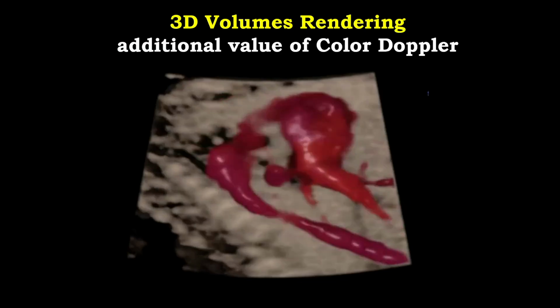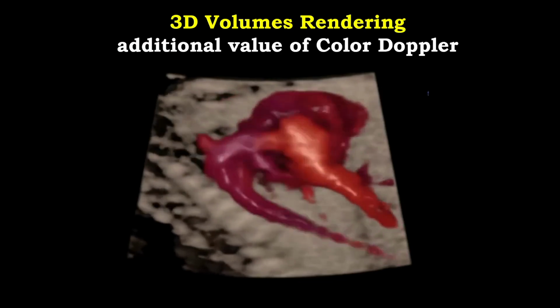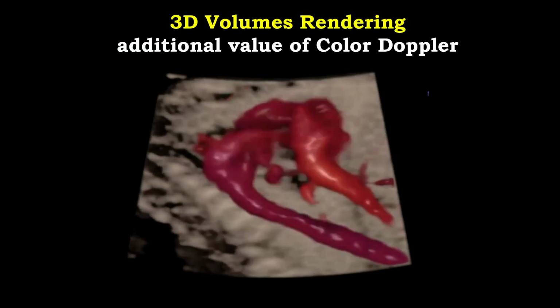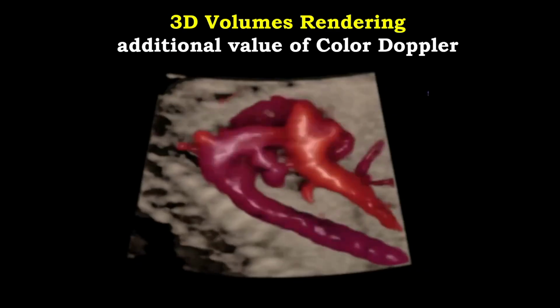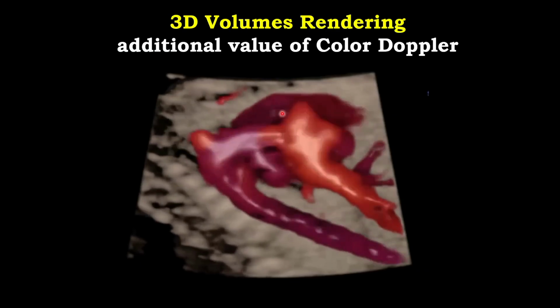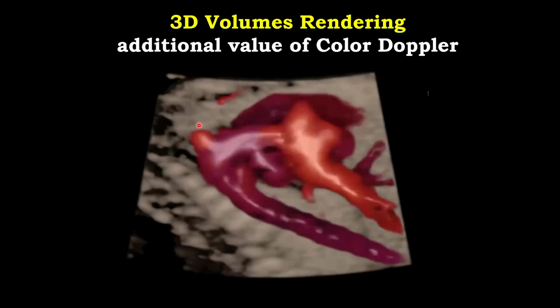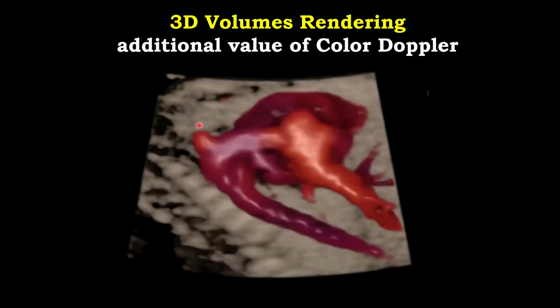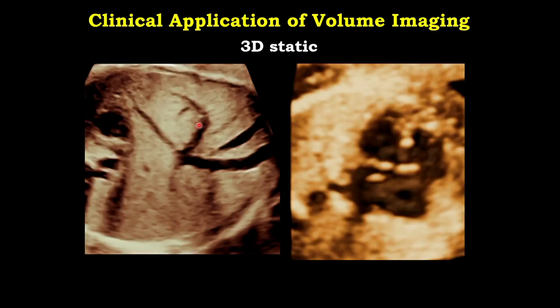We can combine the acquisition of the 3D imaging with color, and this is the sagittal plane as a reference plane, and we can see here the reconstruction of the spatial relationship between all the vascular structures. So we can see the aortic arch, the ductal arch, and the bicaval plane in the same image, and usually then we deal with very complex pathologies, and I showed you this case yesterday, that can be very helpful. So the application of these techniques, I'm going to show you a few examples.